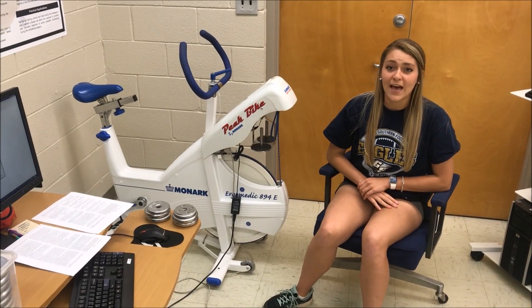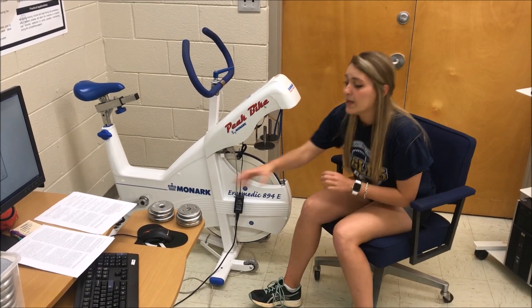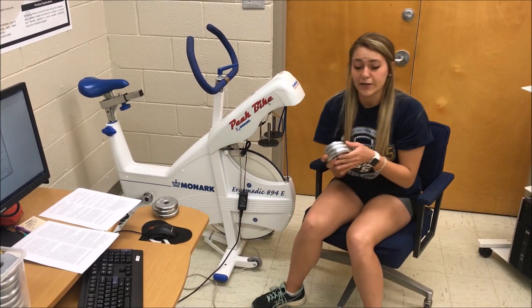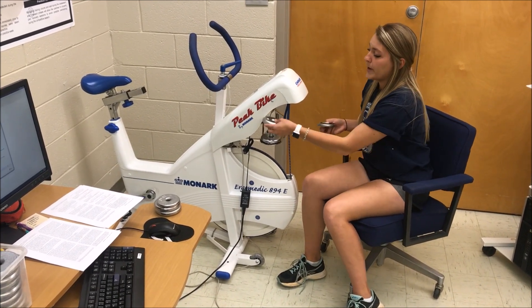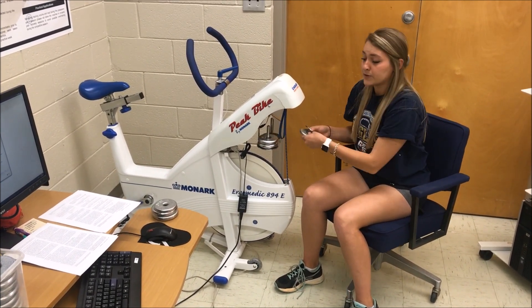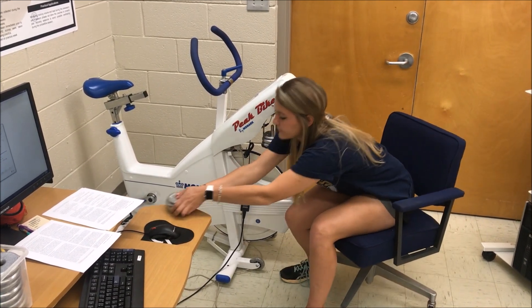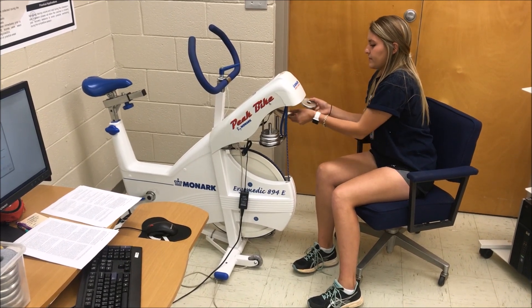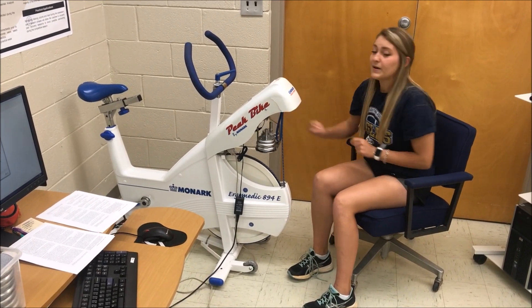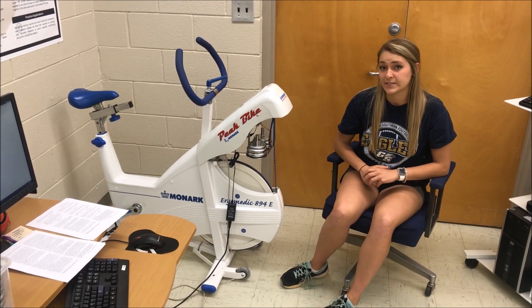To prepare the bike, I will need to add 7.5% of my body weight in kilograms to the load basket. I will do that with this weight here. When you're adding the weight, make sure that you distribute it evenly on both sides of the basket. Finally, pull this lever to make sure that the basket starts in a raised position.